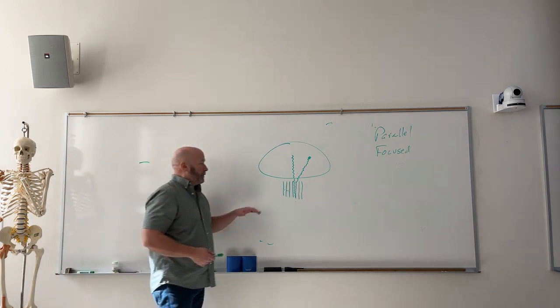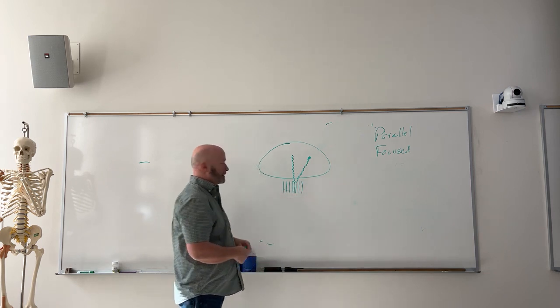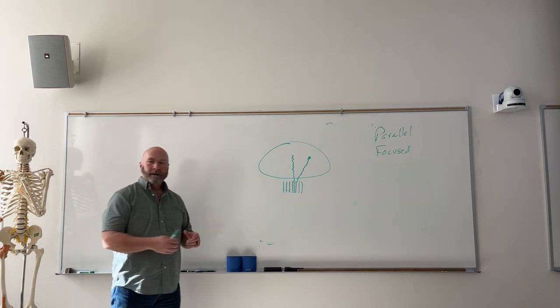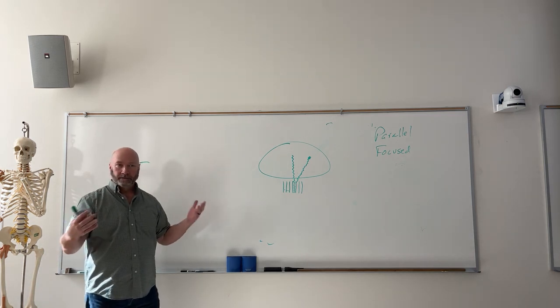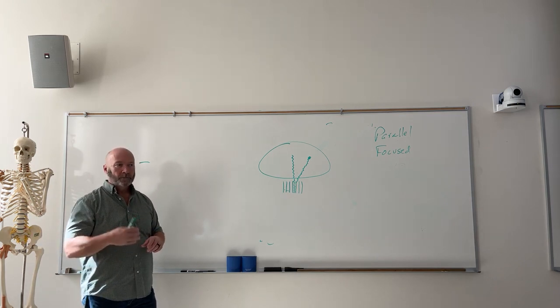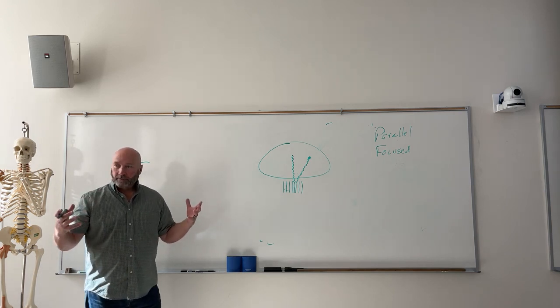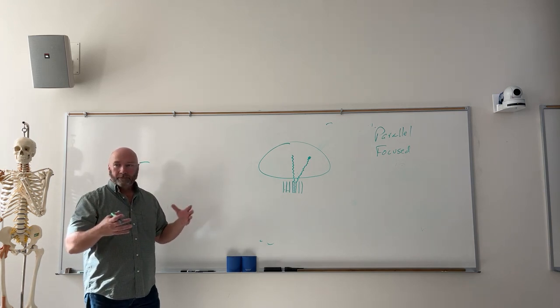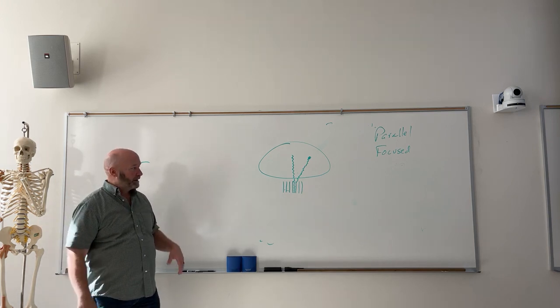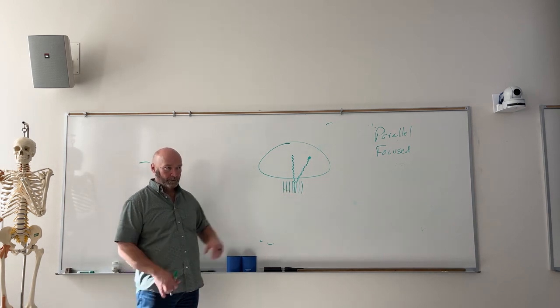So if we have a situation where the grid gets wet with paper interspace material, that same thing's going to happen inside of the grid strip. Anybody ever seen a retaining wall that after a heavy rain like what we just had, it's just falling down? That's what you call hydrostatic pressure. The dirt behind the retaining wall, if it wasn't built properly, absorbs a lot of water and it just knocks the retaining wall down. And that's exactly what happens inside of the grids with paper interspace material.